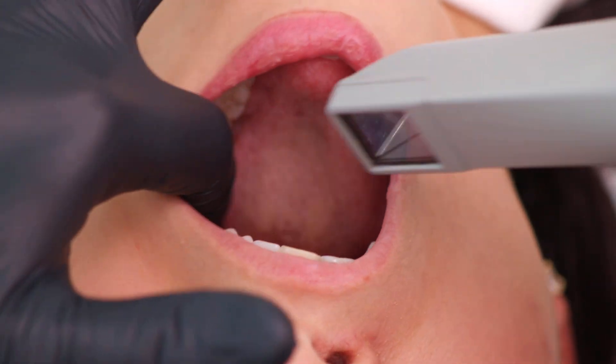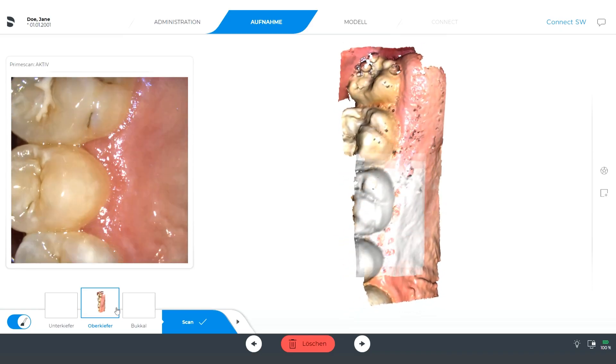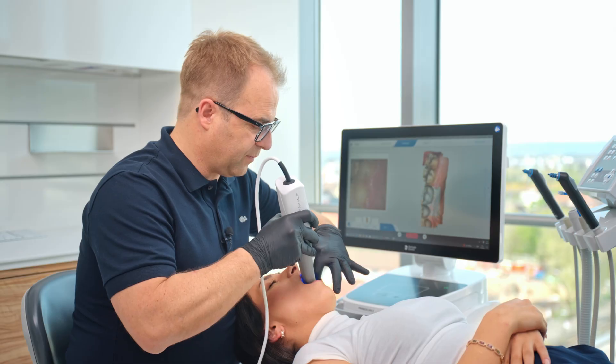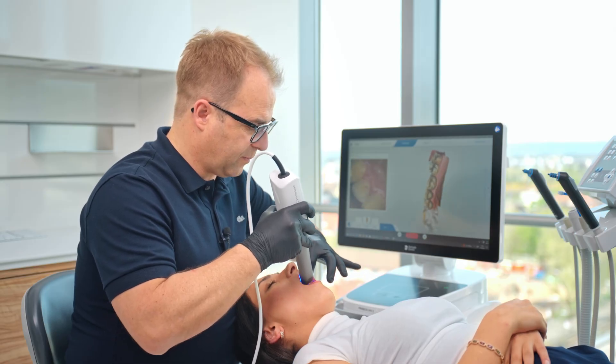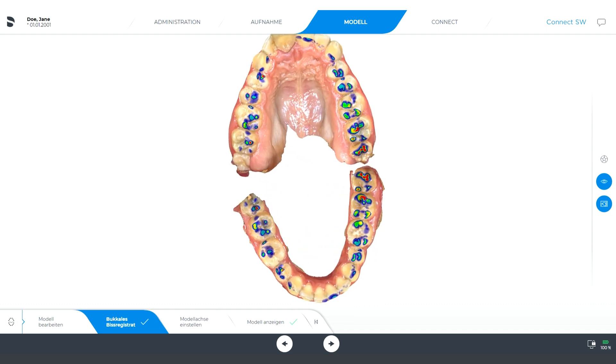The starting point for any 3D print is an intra-oral scan. If you haven't seen our tutorial on intra-oral scanning yet, I highly recommend checking it out. The high-resolution digital scan captures the patient's dental anatomy and is the basis for our print. The scan can be exported as an STL or PLY file. An STL file is the most commonly used 3D format — it can be read and printed by any 3D software worldwide, just like a PDF.